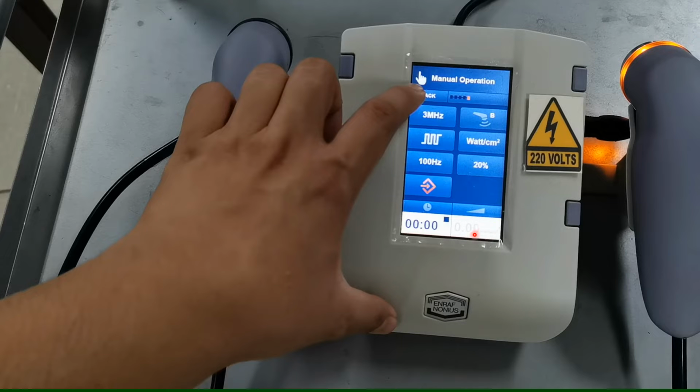Then it will automatically turn on once you have set the time and the intensity. It is turned on if the machine is beeping, which means the ultrasound head is not in contact with the patient's skin.